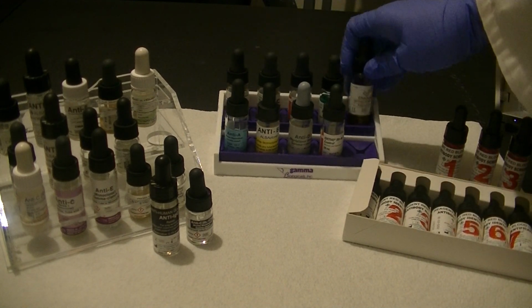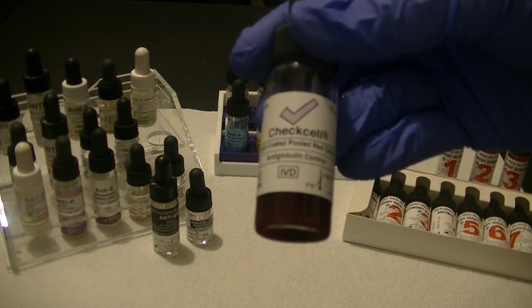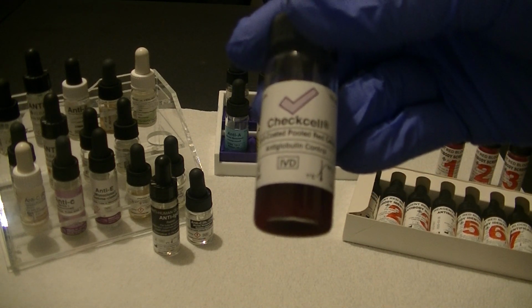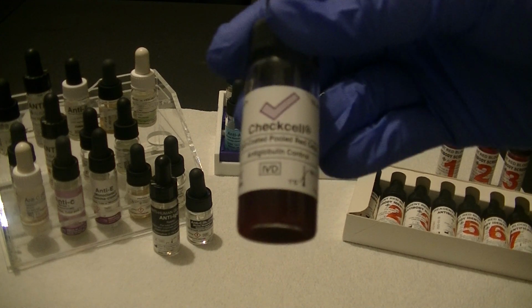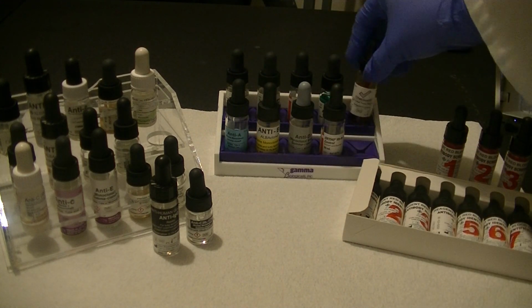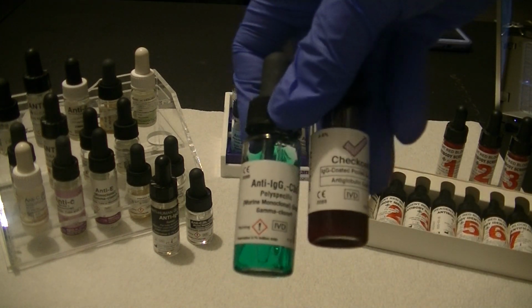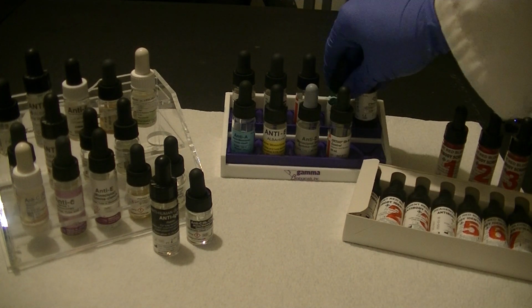There are also some red blood cells known as check cells or Coombs cells that make sure that our anti-human globulin can actually cause cross-linking of red blood cells. So it's kind of like our quality control to make sure our AHG is working.